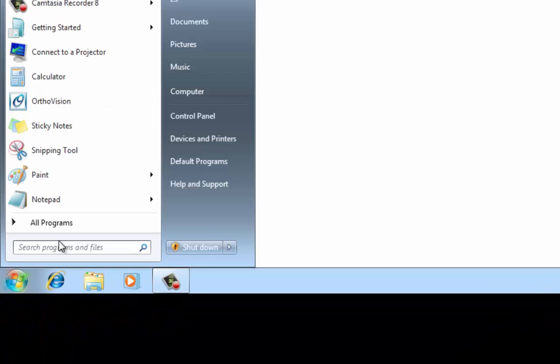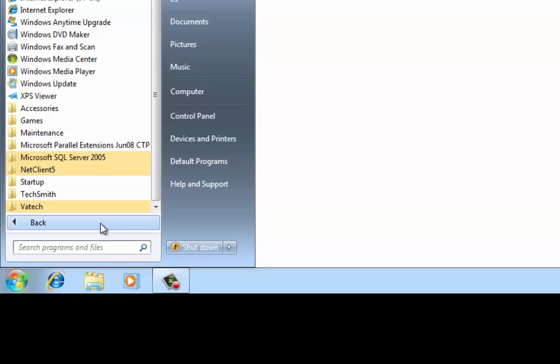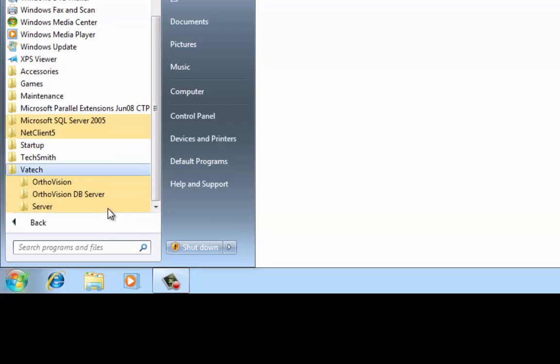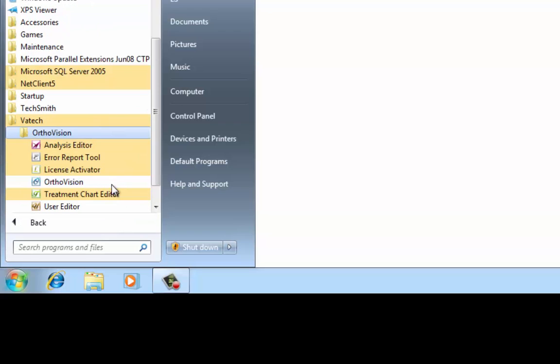To begin, find the VATEC folder in your start menu under all programs. Then in the OrthoVision subfolder, click and open the user editor.